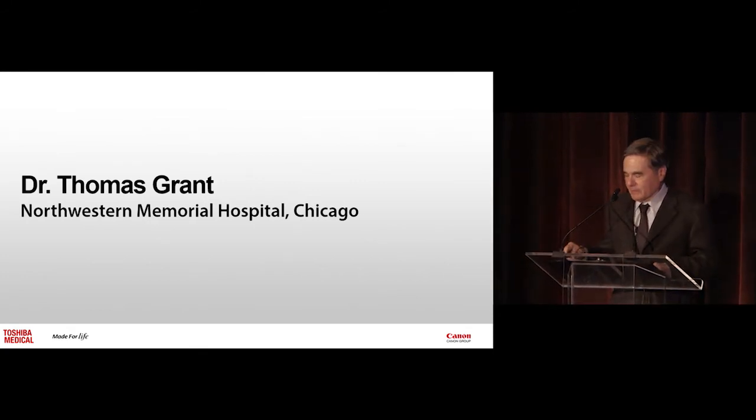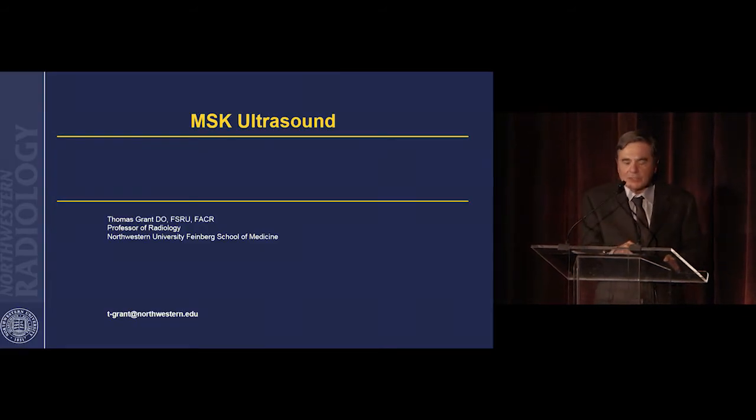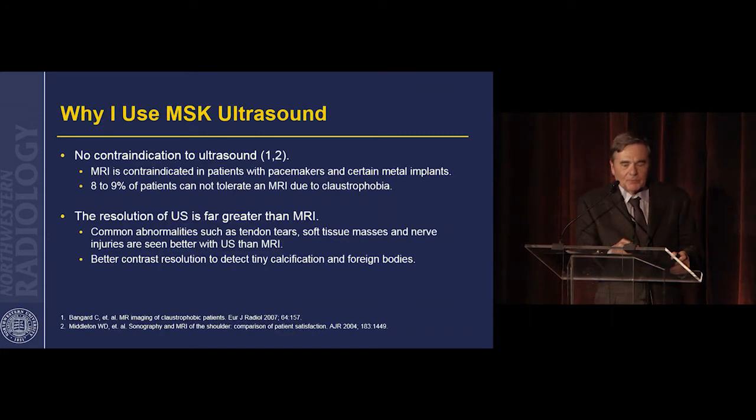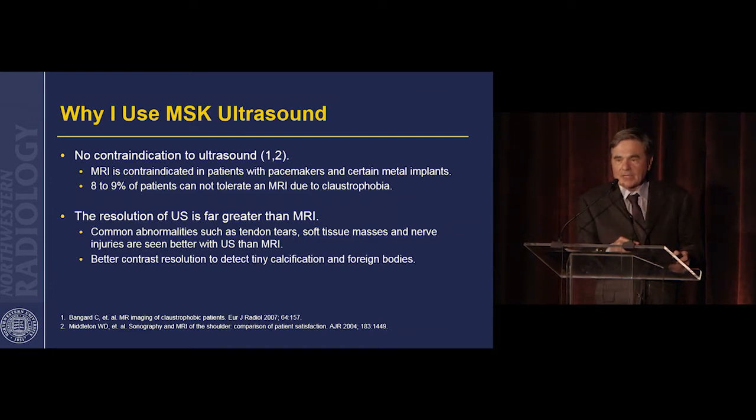Good evening, everybody. I want to thank Toshiba Medical for inviting me and letting me talk on my favorite subject, musculoskeletal ultrasound. Why do I use ultrasound for MSK disorders? One is there's no contraindication. There's great patient interaction. The resolution of ultrasound is really quite a bit superior to MRI, especially when you're talking about nerves and tendons and muscle disorders. There's much better contrast resolution as well.